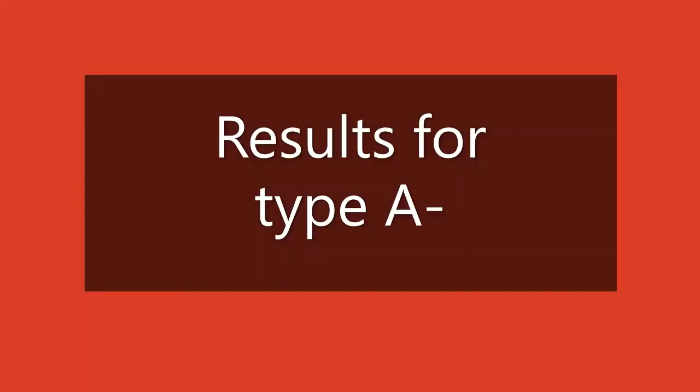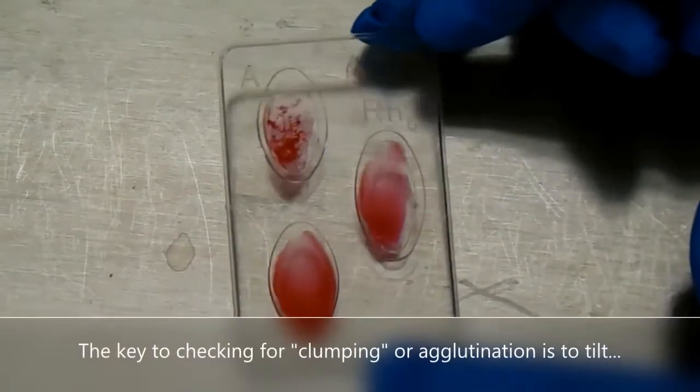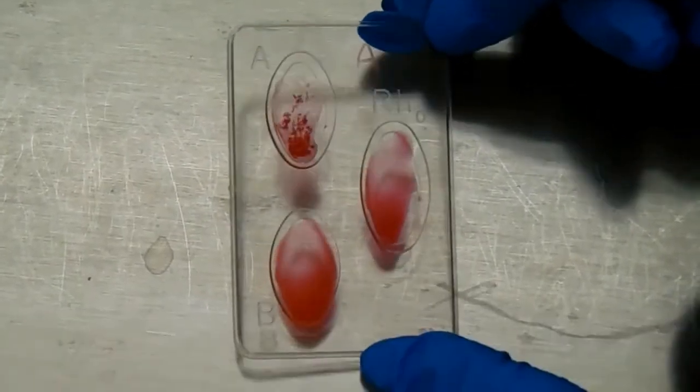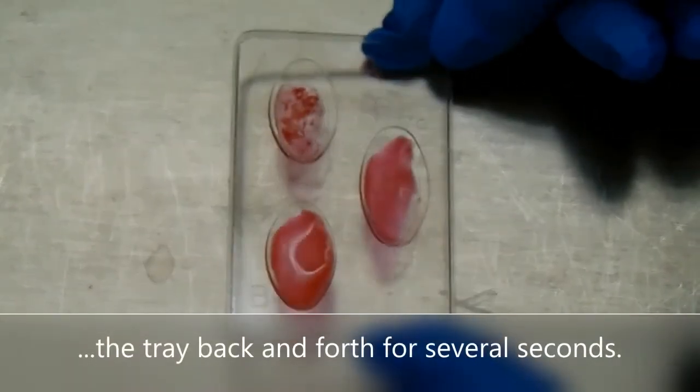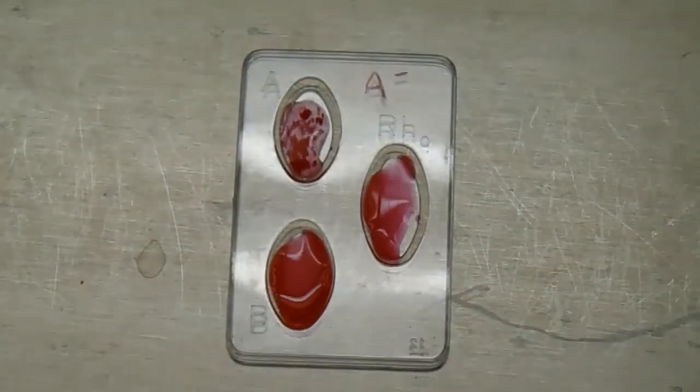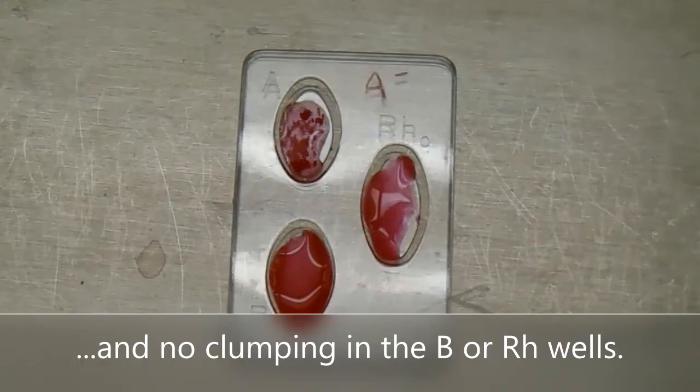Results for type A negative. The key to checking for clumping or agglutination is to tilt the tray back and forth for several seconds. Here we can see large distinct clumps in the A well, and no clumping in the B or RH wells.